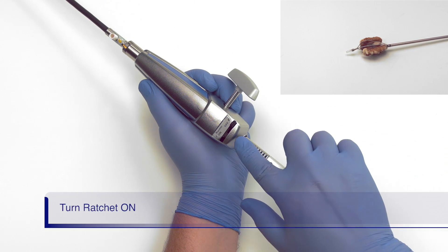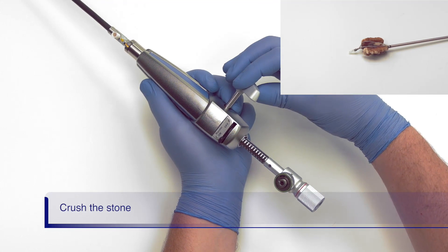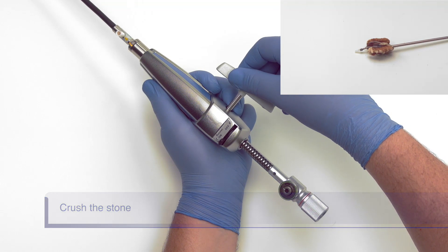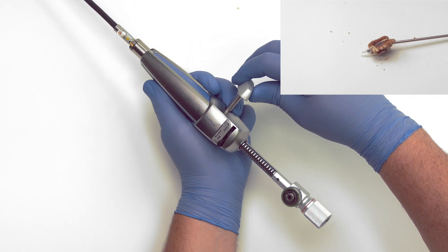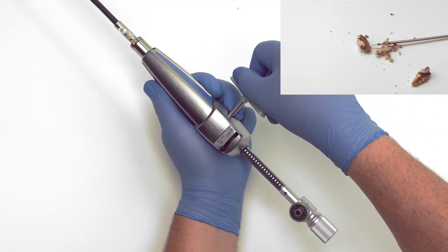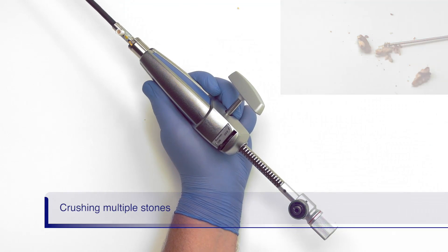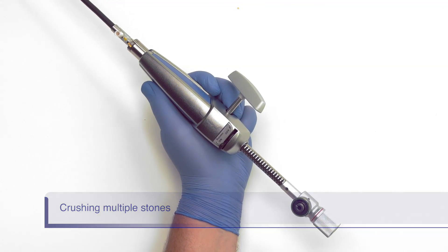Push the ratchet switch into the on position. Slowly turn the handle to close the basket around the stone and eventually crush the stone. It is important to turn no faster than you see here, or the stone can slip out of the basket. Lithicrush V can be used to crush multiple stones. However, you will need to crush each stone one at a time.